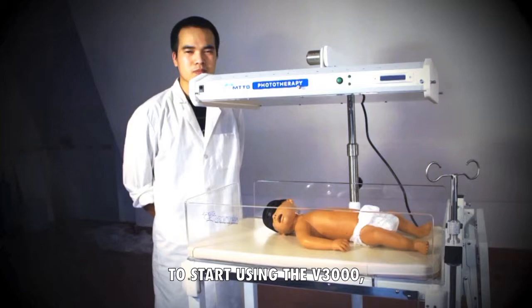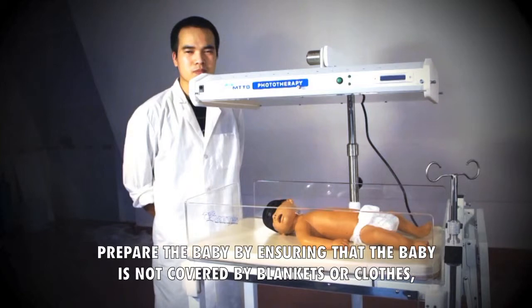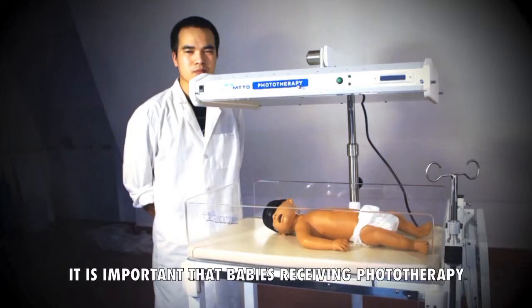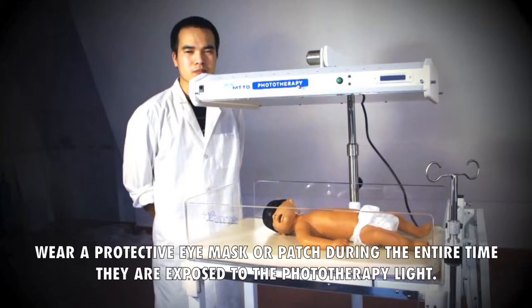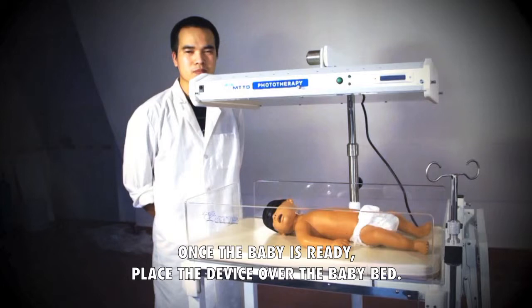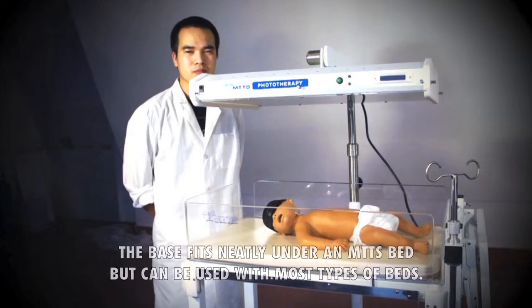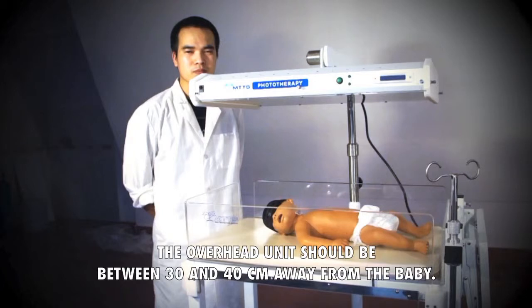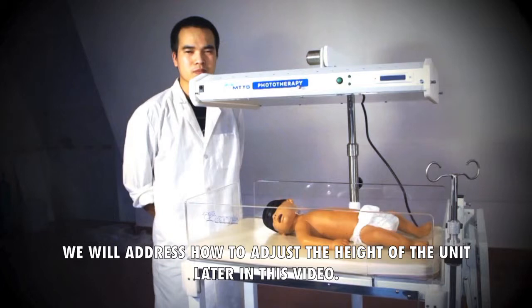To start using the V3000, prepare the baby by ensuring that the baby is not covered by blankets or clothes other than a diaper or diaper cloth and eye covering. It is important that babies receiving phototherapy wear a protective eye mask or patch during the entire time they are exposed to the phototherapy light. Once the baby is ready, place the device over the baby bed. The base fits neatly under an MTTS bed but can be used with most types of beds. The overhead unit should be between 30 and 40 cm away from the baby.